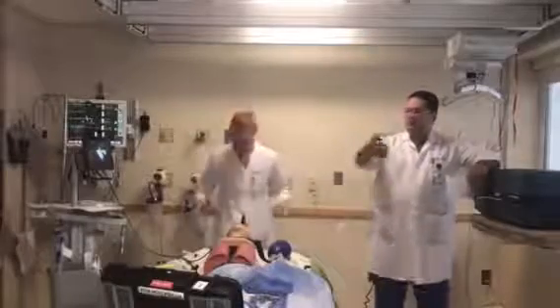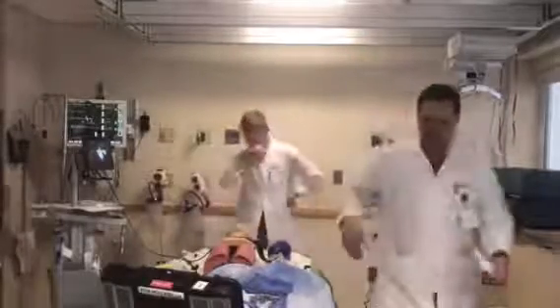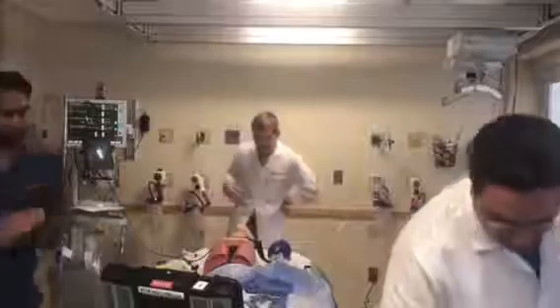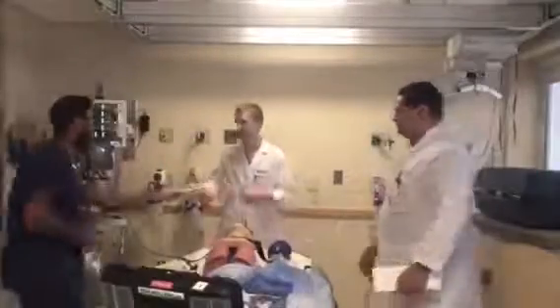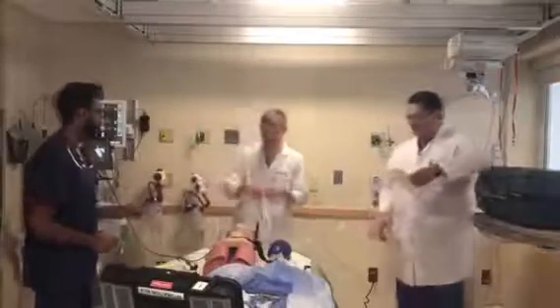All right, so it's in the third drawer. One second. I'm the nurse because no nurse wants to help me here. Alright, right here. No. Oh, give him this. Give him this. What is this called? Can I have a lube, please? Lube is here.